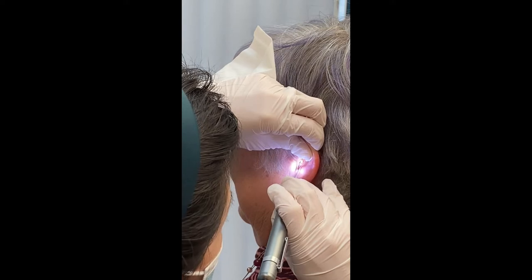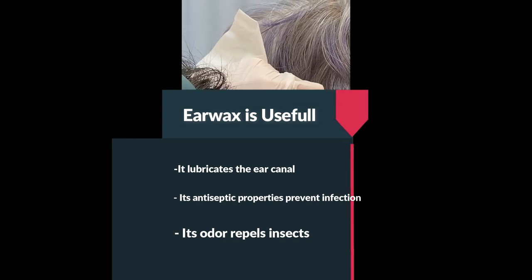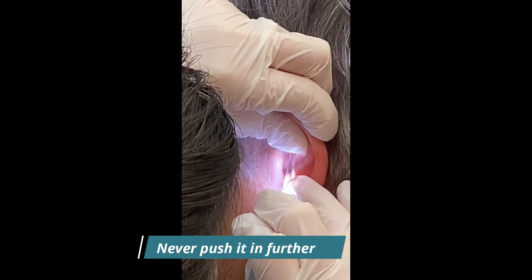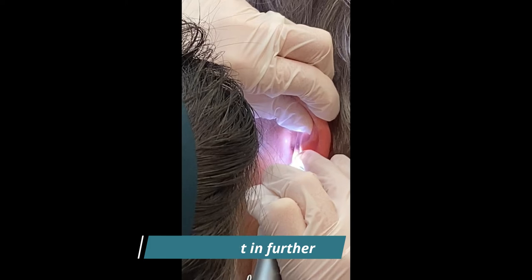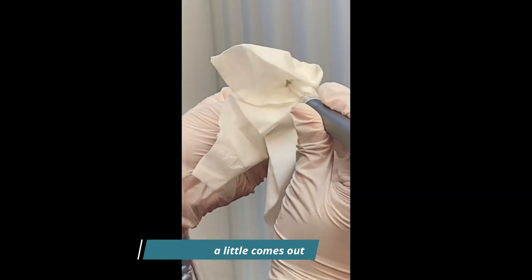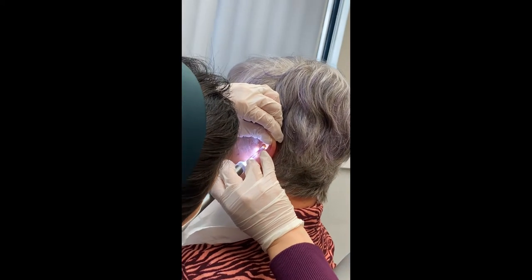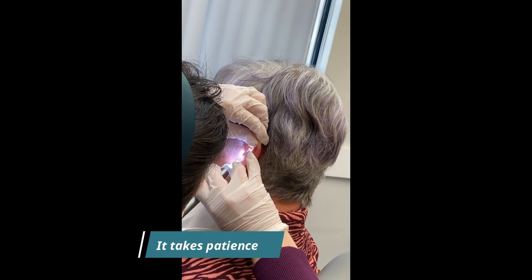Doing okay? Yeah. Okay. I got a little bit. Oh. Yeah. Doing okay? Mm-hmm. Okay, good.